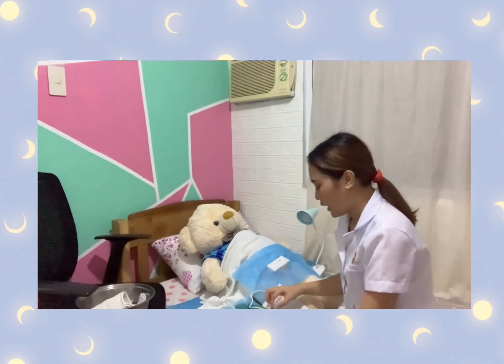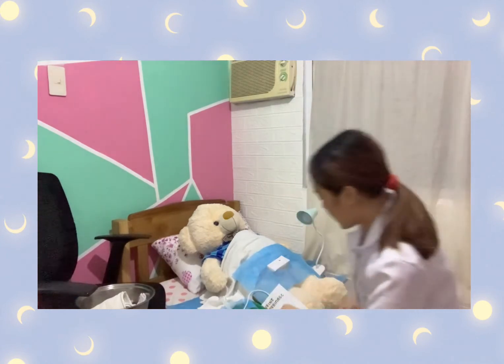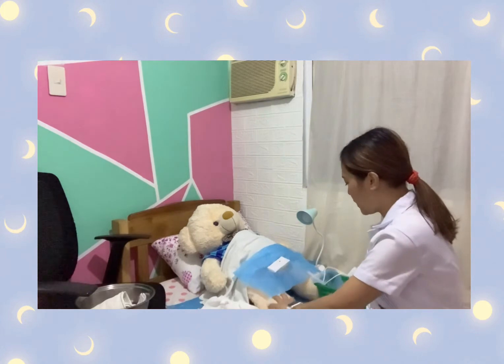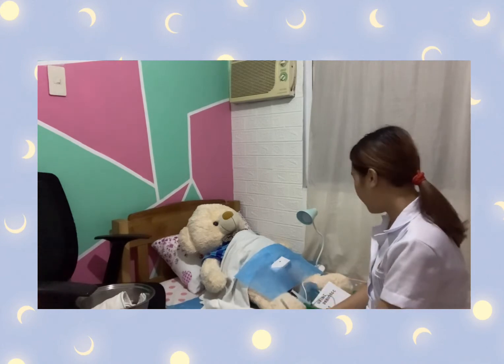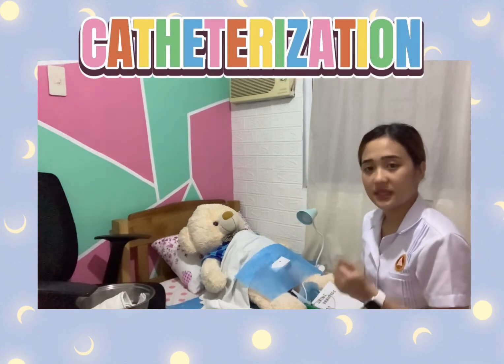After lubricating it, we will put antiseptic solution on the cotton balls. And then, we can now put the tray between the patient's hips, or legs, rather. After that, we can now perform the insertion of the catheter.